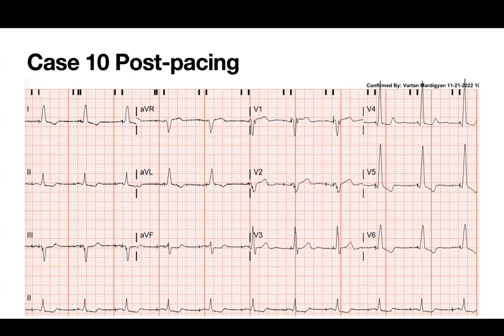I could have shown you the thing. Because here you see this, you're not counting this. If you count this, it gives you an extra 40 milliseconds on top of it. So it was really like 110, the LVAT 110.